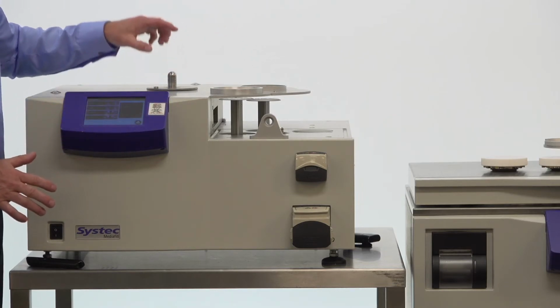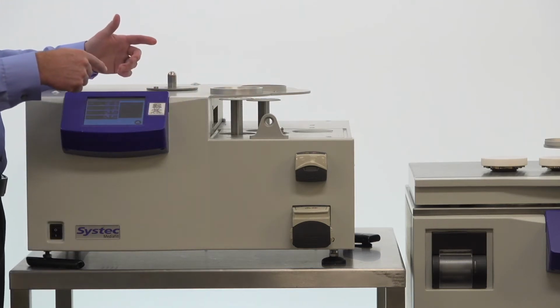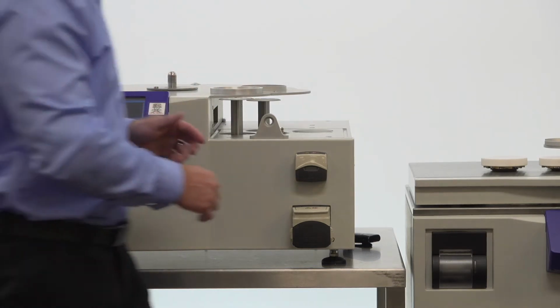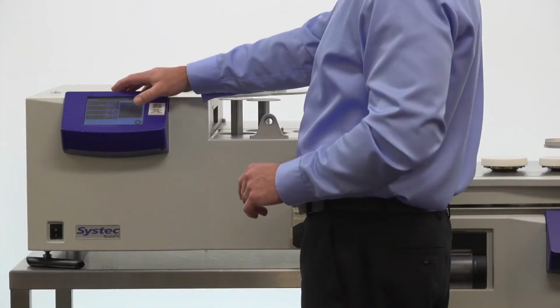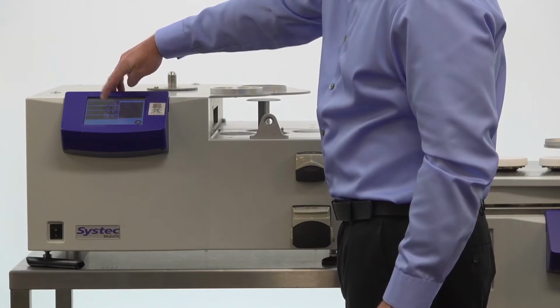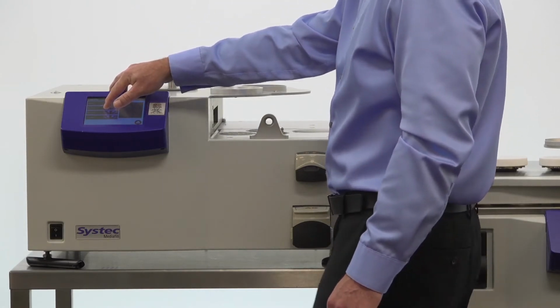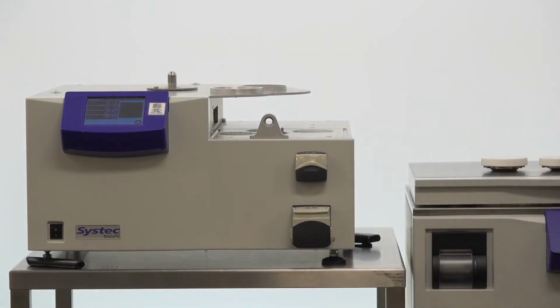But again, we can move the carousel and also the revolver if we want to in this position in the cleaning mode as well. Once we've cleaned everything and we want to put everything back into position, we can just drop these pistons back into place and then put items back in.